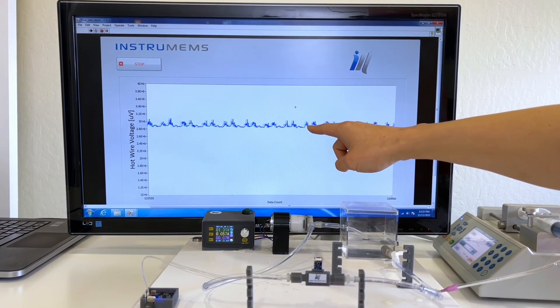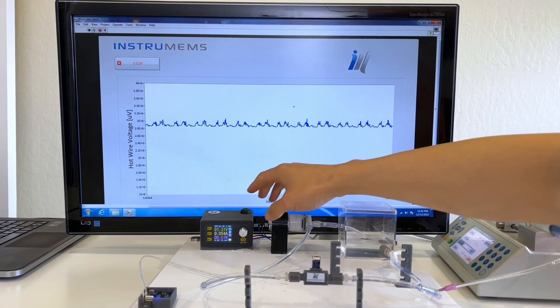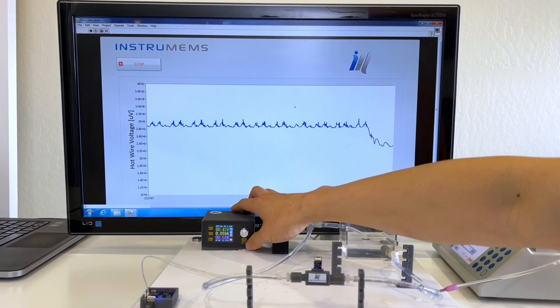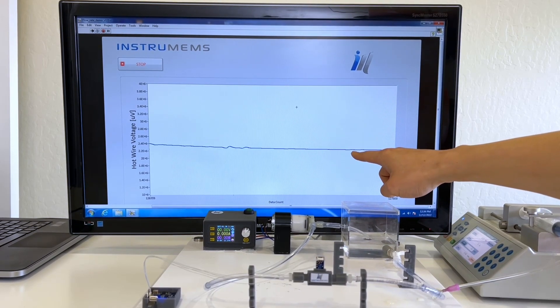The design of the sensor allows users to accurately measure at low flow rates. Turning off the pump, the signal cleans up and falls to the no-flow level.